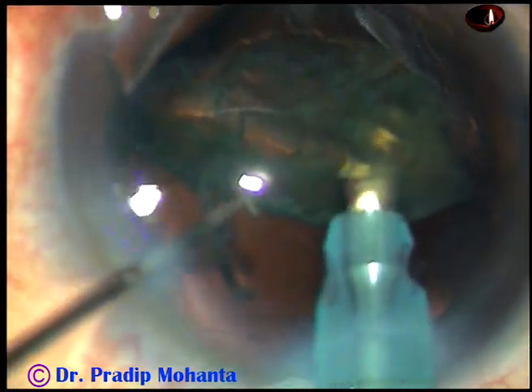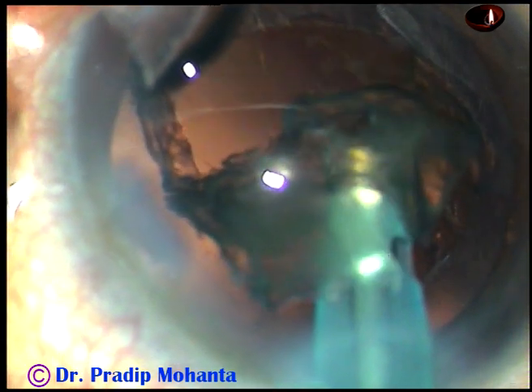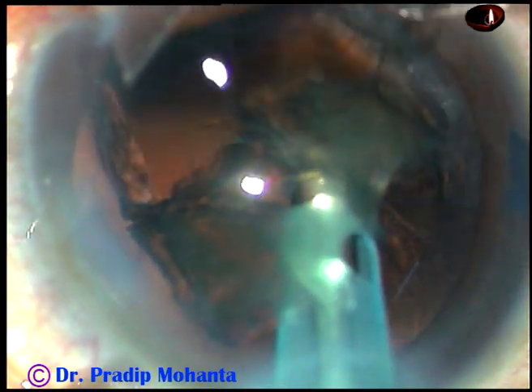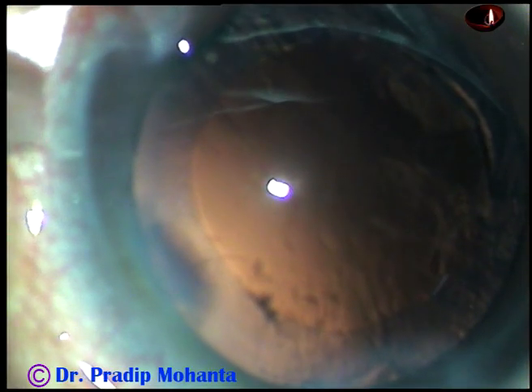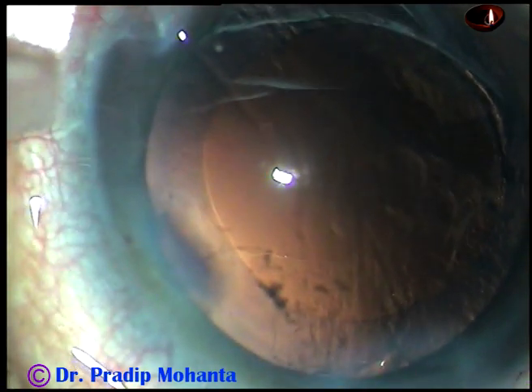Softer cataracts are harder to manage. This cataract is soft, but you have to be a master in managing soft cataracts. All the money comes from soft cataracts — patients with hard cataracts are usually poor. So be a master in managing soft cataracts.